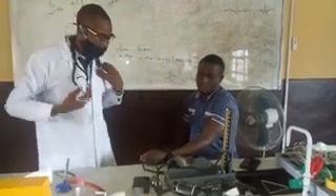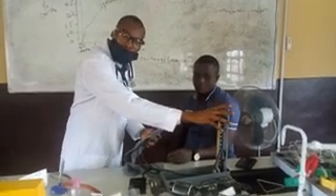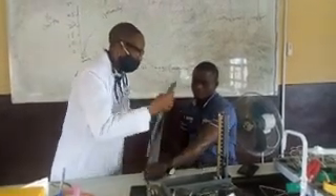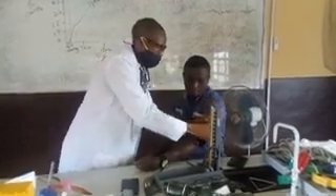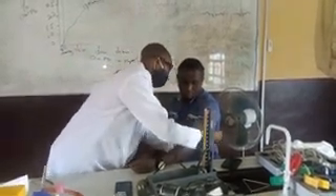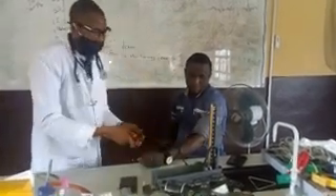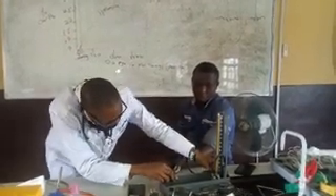Before we do that, we need to tie the cuff of the table-type manual sphygmomanometer on the arm. You place the cuff on the arm and make sure it is firm. Once that is done, you lock it and turn on the mercury.